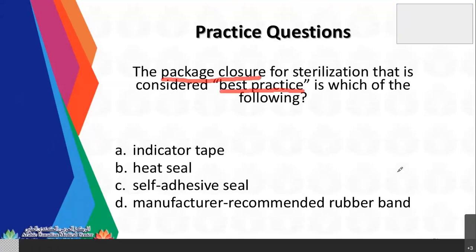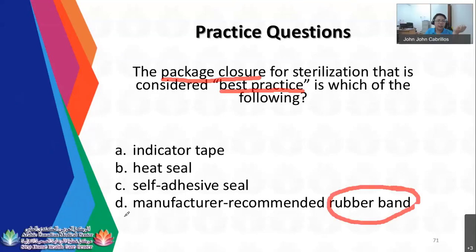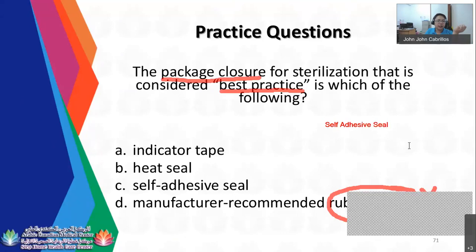So for this practice question, the package closure for sterilization that is considered best practice is which of the following? I will eliminate first the manufacturer recommended rubber band. A rubber band is not recommended for closure of any packages. So there are two types of closing packages or pouches. For pouches, guys, we have the self-adhesive seal and your heat seal.